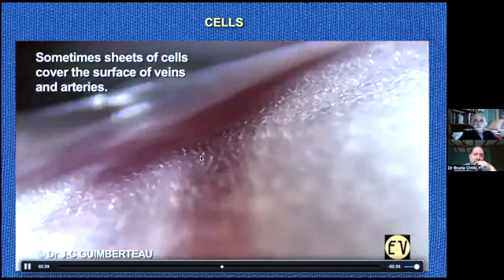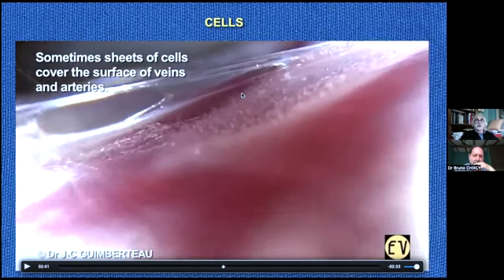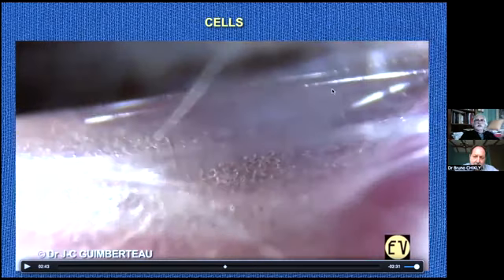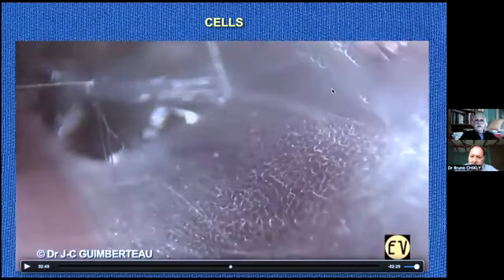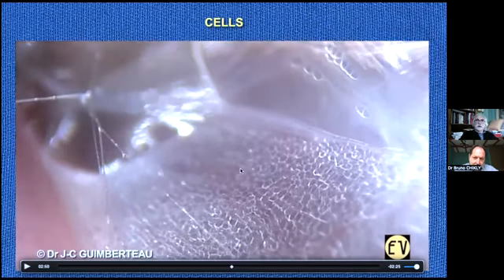And something also surprising. Here you have thousands of cells around a vein. You see cells here, everywhere you have cells. Thousands and thousands and thousands. So with my endoscope, I am observing all these cells. Wow, it's beautiful. And look here, a fiber here, cells here. And suddenly, look what I see.